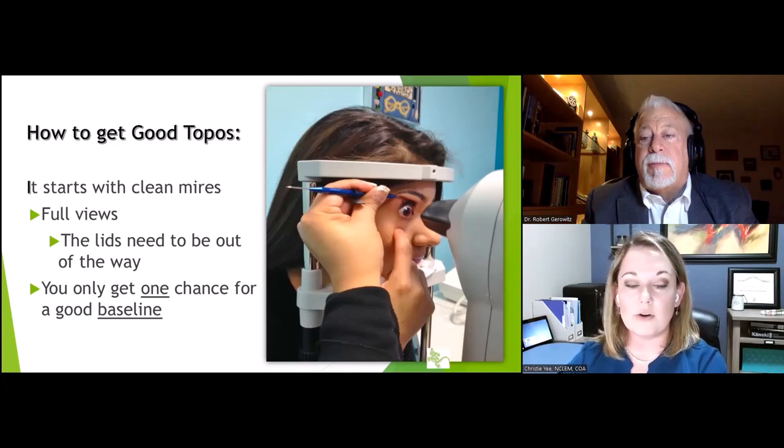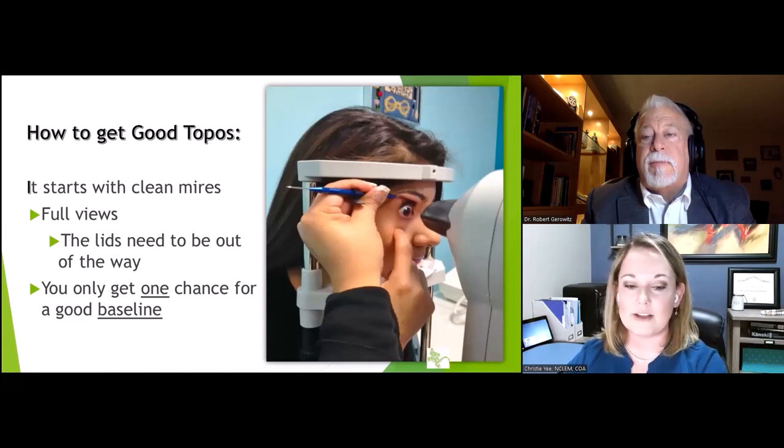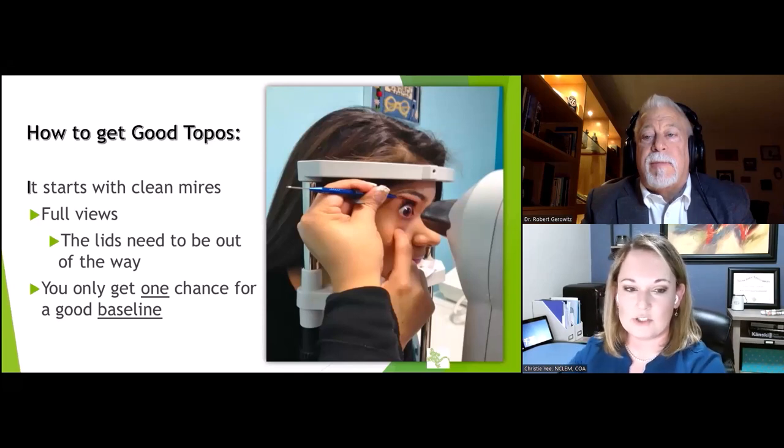And so, if you've got 10 minutes, spend the time with your team so that they recognize the difference between a good quality picture, like you mentioned, and one that is not great quality. And let them know that it's okay to invest the extra 5 minutes, use an artificial wetting drop if needed to get that better picture. But the extra 5 minute investment to get a good topo on the front side is worth sometimes hours of chair time later on trying to troubleshoot something that isn't working right. So again, that's a really great tip that you've shared.